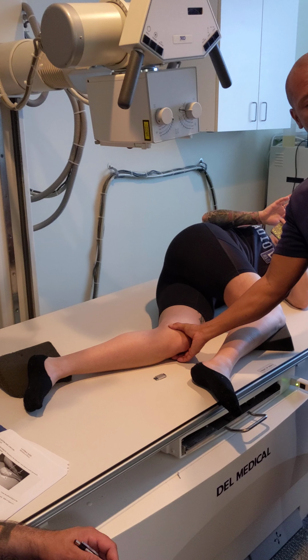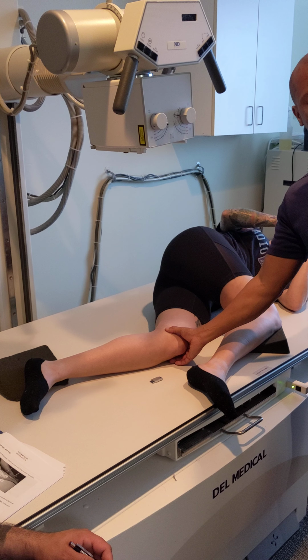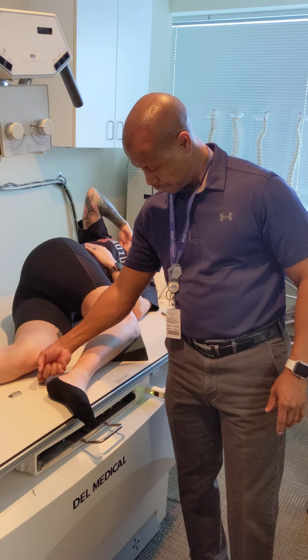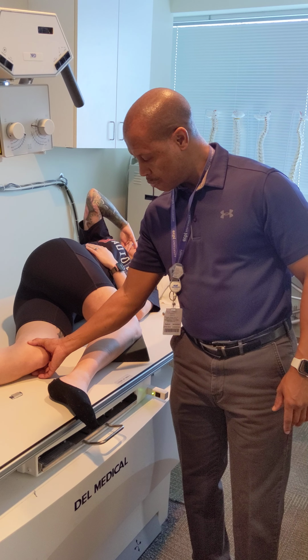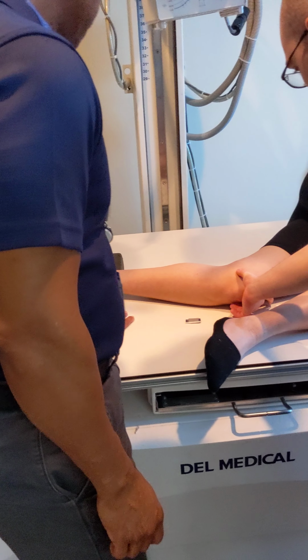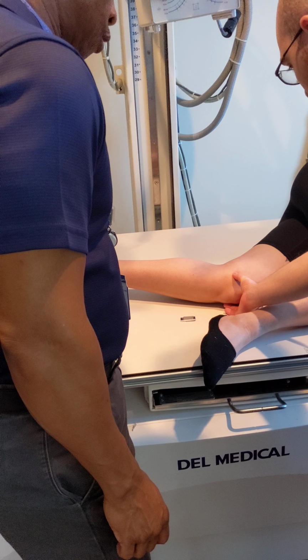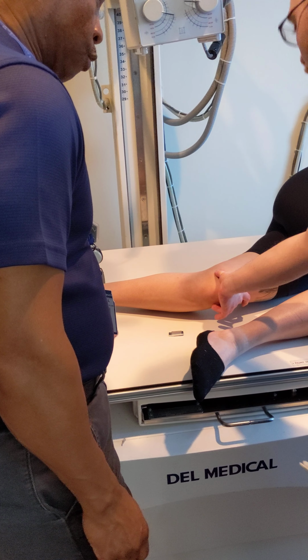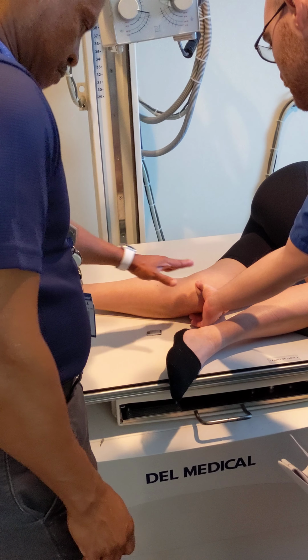Yeah, because right now, think of it like this. The condyle should be perpendicular to the table. Yes. So really they should be like this. So come on over here, I want you to feel. All right, so put your hand on both. Now, all right, I'm going to have her, okay, roll your knee. That we don't want. Okay. Go the other way. That we don't want. Okay. That's what we want.